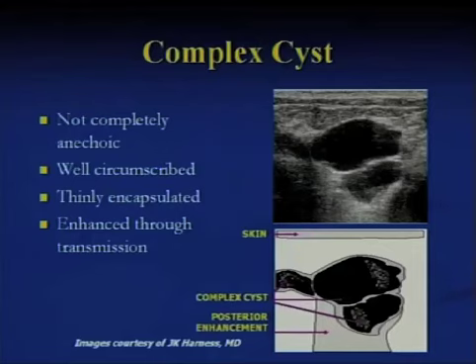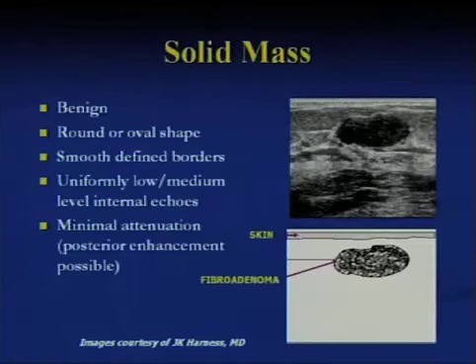Here's a good example of a complex cyst — we learn how to describe it. It's not completely anechoic; anechoic means black, meaning no internal echoes. Here you can see a bunch of material as internal echoes, typical of a complex cyst. The margins are reasonably well-circumscribed, it's thinly encapsulated, and there is enhanced posterior transmission. Here's a palpable mass that is round and oval in shape, reasonably smoothly marginated, with relatively homogeneous internal echoes.